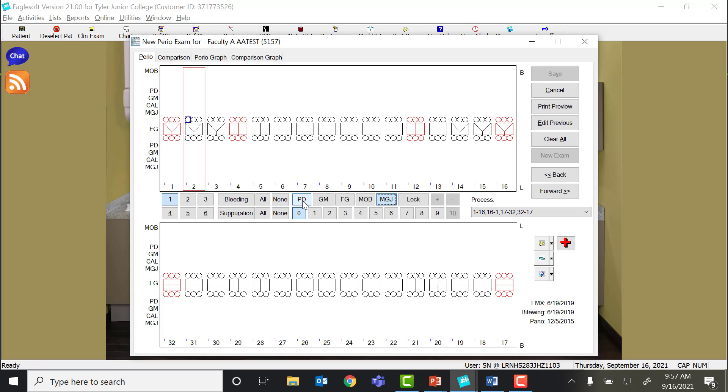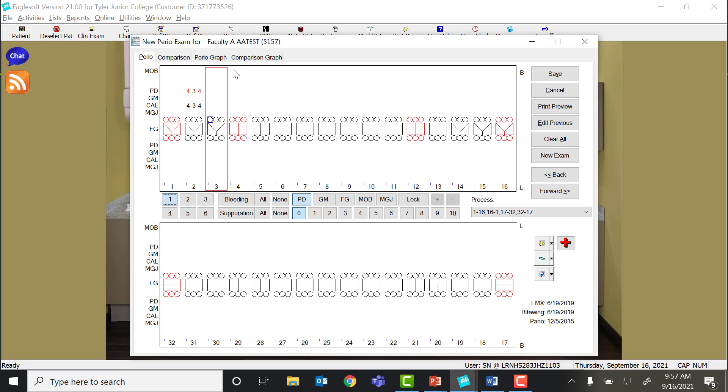We are going to start off with just some simple probe depths to get started in the program. In order to tell exactly where you're at, the program highlights the entire tooth with the red box around it, and then the exact location with the little blue box.